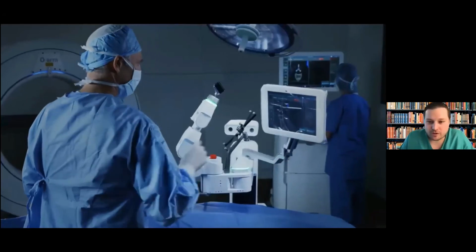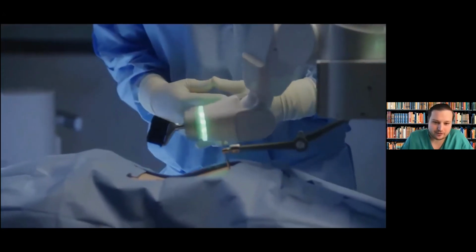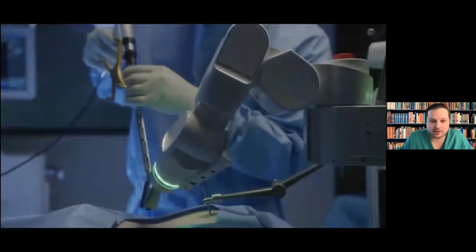And then once you have your plan, all you have to do then is start the robotic arm. The robotic arm comes down, and then you're working in exactly where you thought you were working.